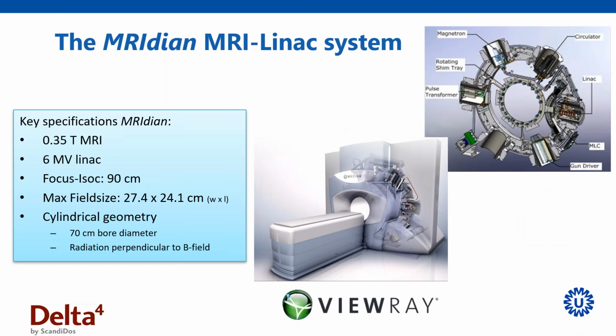I know there is, of course, another MR-Linac system called the MRIdian. It's made by ViewRay. I don't have any experience with that, but I know that they sold a lot of those machines. And to give you the key specifications on that, it's a 0.35 Tesla MRI. It has a 6 MV linear accelerator, where in the past they equipped it with 3 cobalt sources. And they do have a focus isocenter distance of 90 centimeters, and their maximum treatment field size is 27.4 times 24 centimeters. So it's a bit smaller than what we can treat on the Unity machine. It also has a cylindrical geometry, and the bore diameter is the same as on the Unity machine, where also the radiation is perpendicular to the B field.